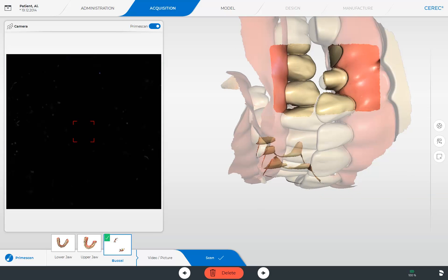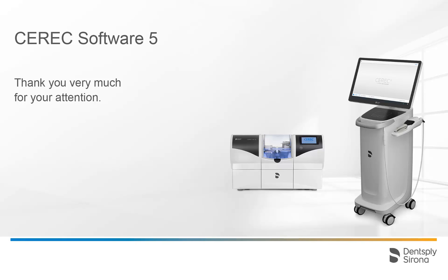After successful scanning of the default image catalogs, we can switch to the next phase — the model phase — either by tapping the arrow to the right at the lower edge of the screen or on the phase bar. Thank you very much for your attention. We would like to wish you every success when working with CEREC.